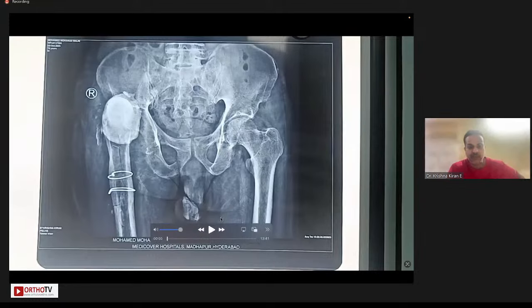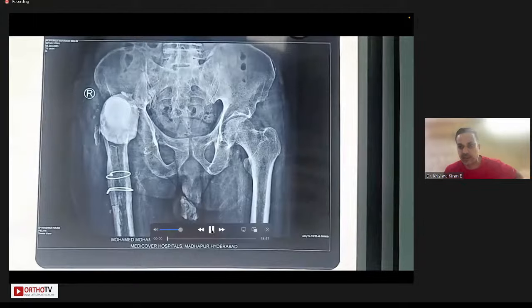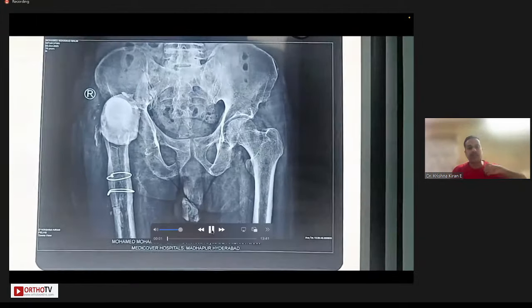So we have seen how we can retain the femoral component and just do an isolated socket revision using a four-step release process for the femur, and the key to acetabular exposure is the femoral mobilization. So you go more distal on the femur for better acetabular mobilization.